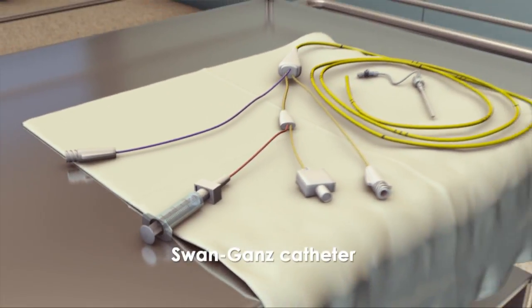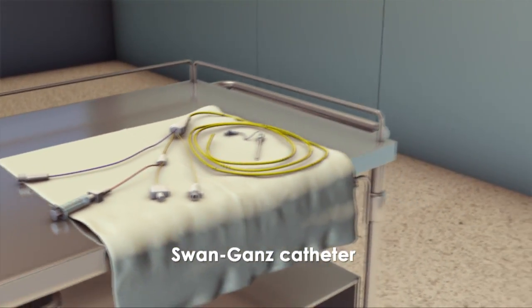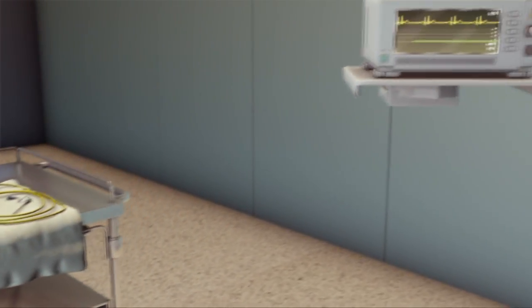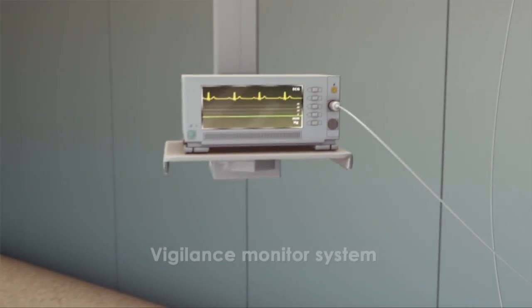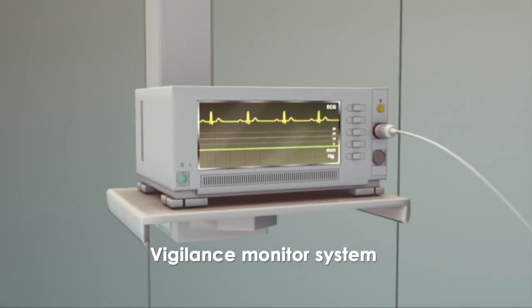The right heart catheter is the most important diagnostic tool for pulmonary hypertension and, given a thorough introduction, not complicated to use.